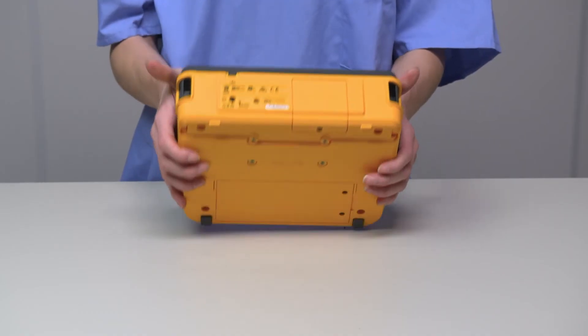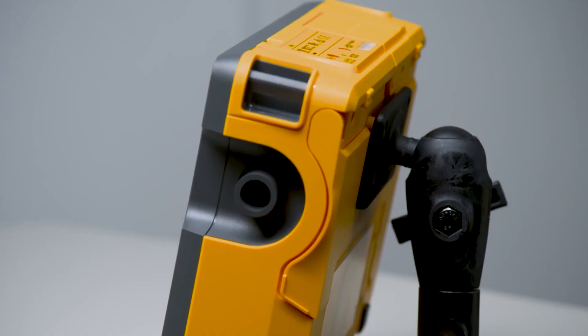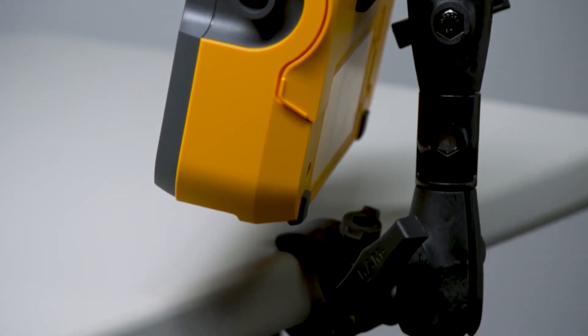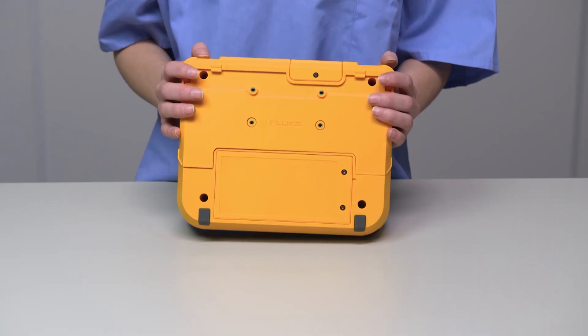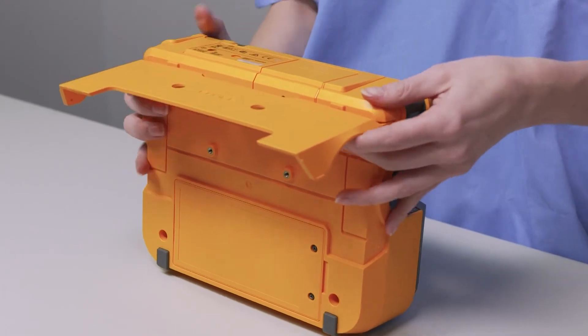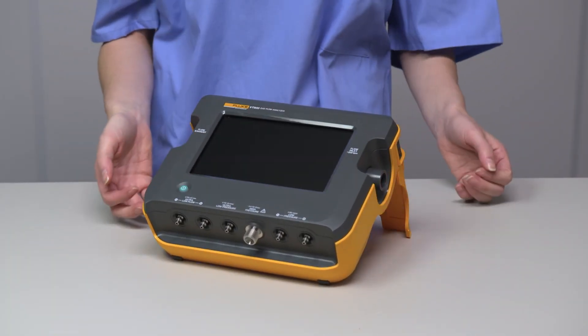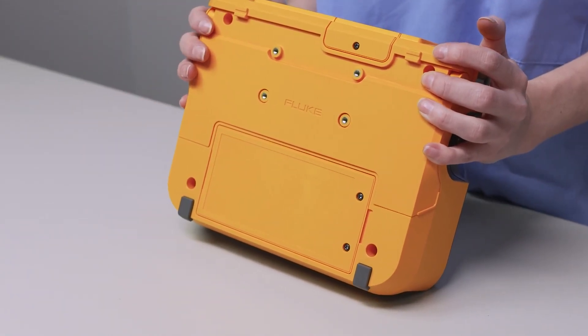On the back of the device are four screw holes for a VESA mount. Use this VESA system to mount it to your lab bench, or purchase the optional test arm and clamp the device to any surface you desire. The unit is equipped with a bale that allows for an alternate viewing angle to help protect from glares and for your comfort and ease of use. This is the battery compartment for a rechargeable battery that lasts about 8 hours.